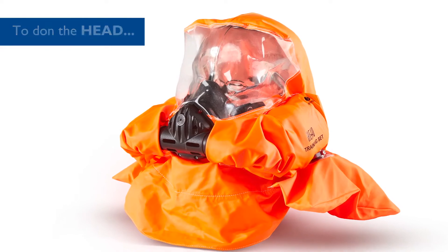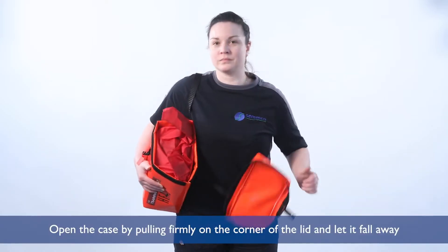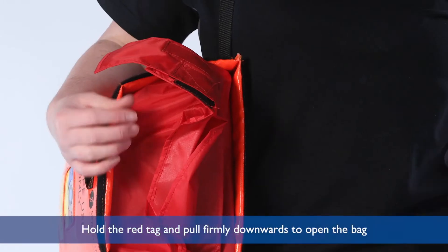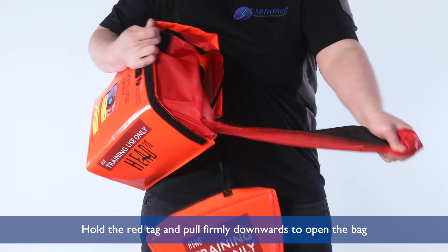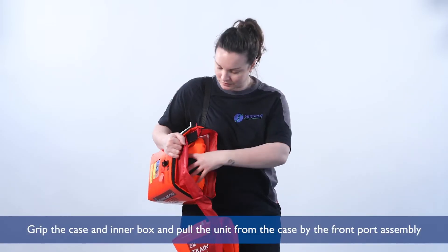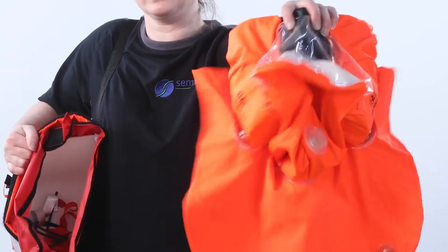To don the head, open the case by pulling firmly on the corner of the lid and let it fall away. Hold the red tag and pull firmly downwards to open the bag. Grip the case and inner box and pull the unit from the case by the front port assembly.